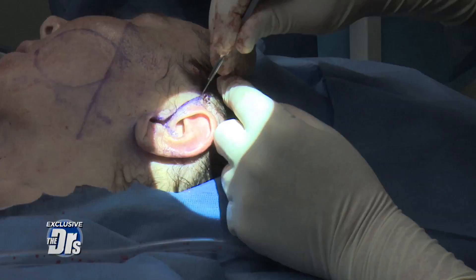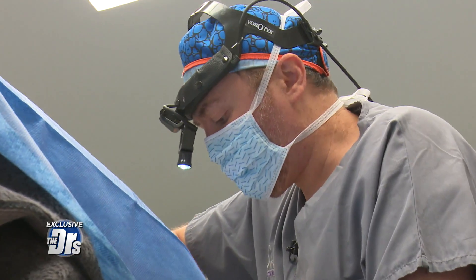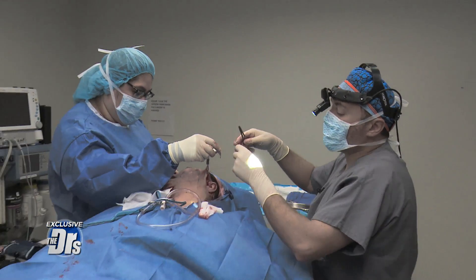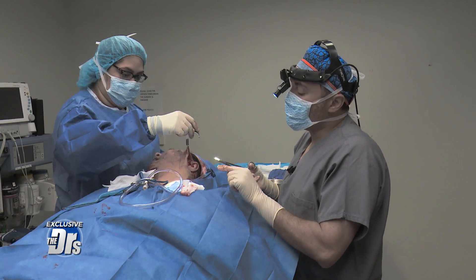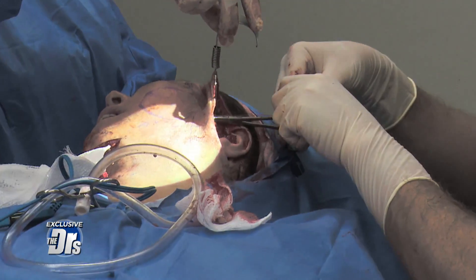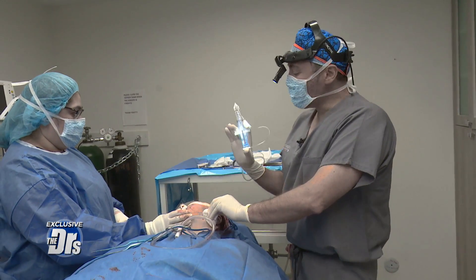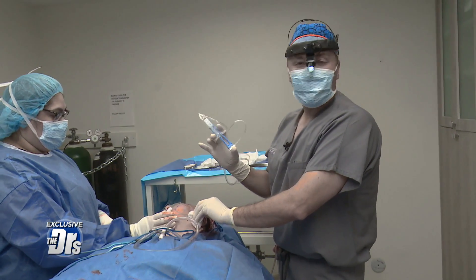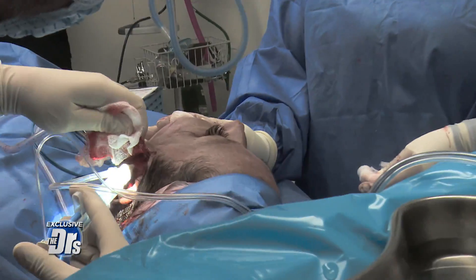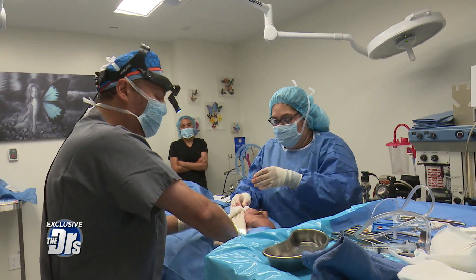Now we're starting with the face, and we're making tiny incisions around the ears to get access to the facial fat and muscles. The second part of the procedure in the face involves using sutures to lift up the fat and muscles. You can see the face gets lifted. One of the coolest parts of this procedure is to use the tissue glue — this is actually that super glue that we're going to spray underneath the skin. Everything is going to be glued in, closed, and sealed.